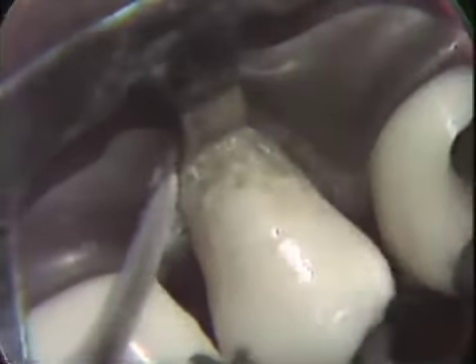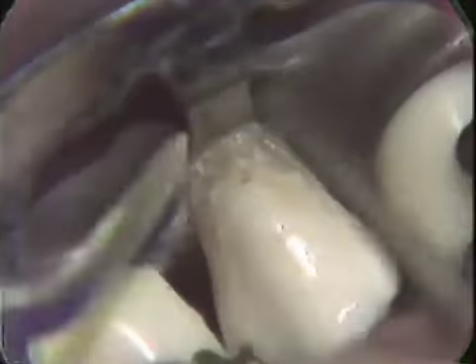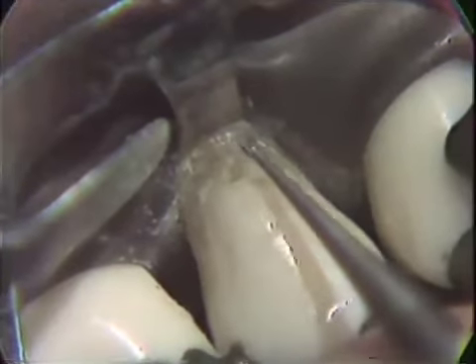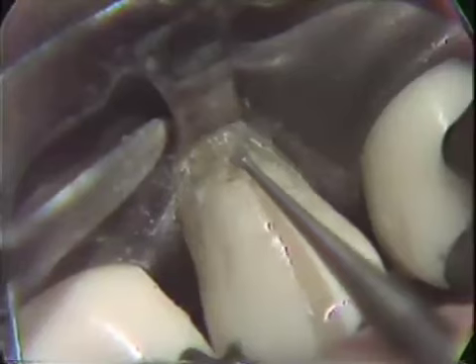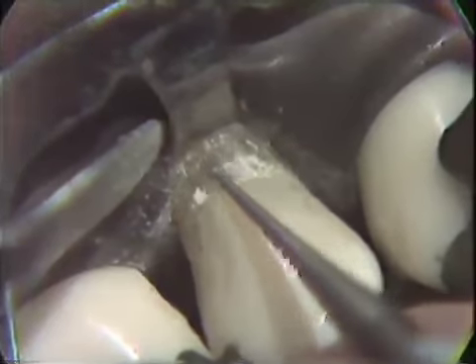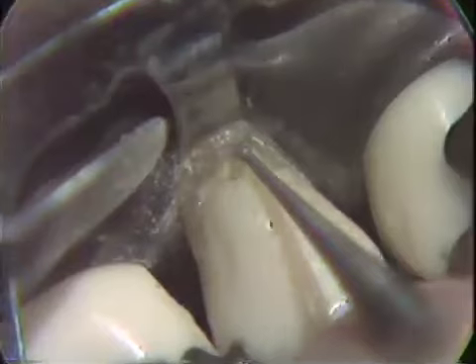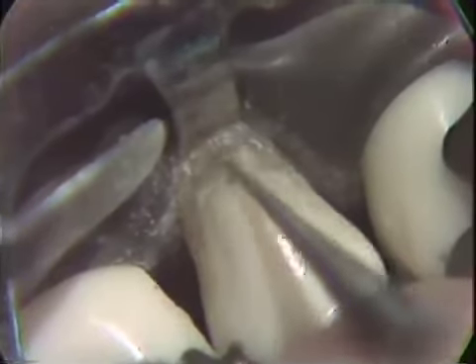Now we've extended there, and we'll now move into the position at the cervical, again using the base of the burr to establish that cervical wall. Joining together the two sides, the mesial and distal wall.